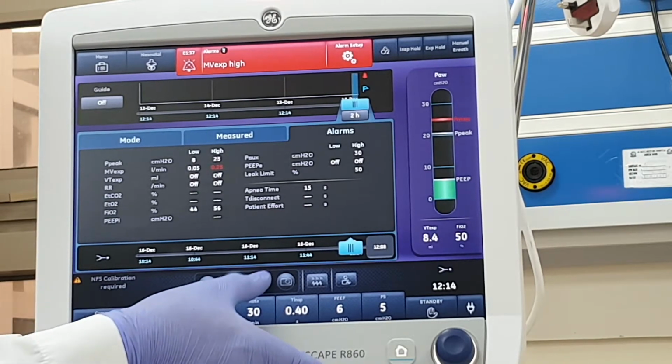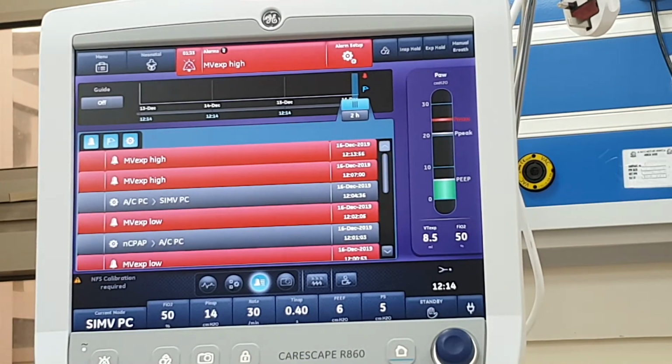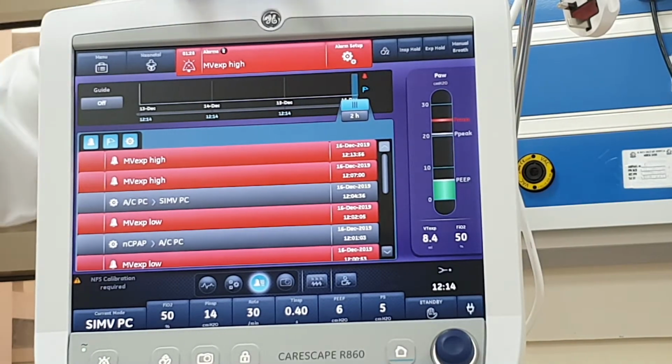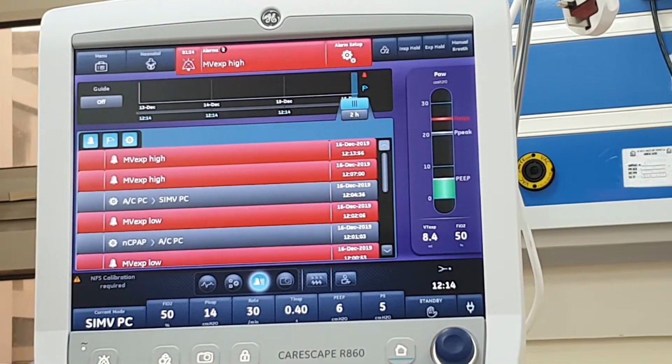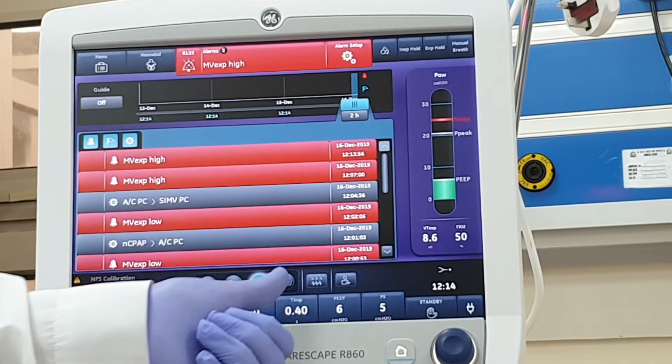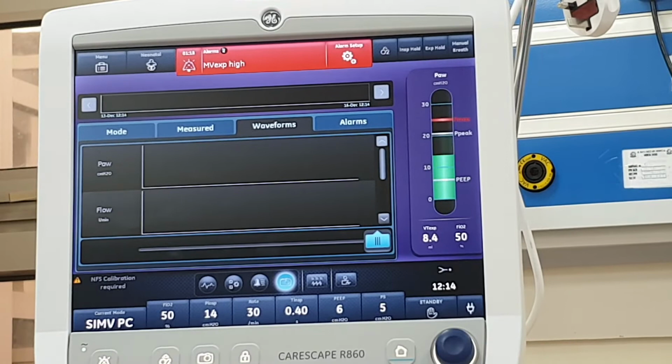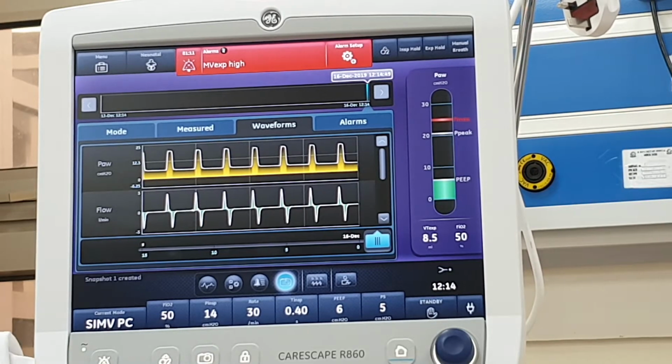Okay, well the third one, it will display all the alarms for you. So you could simply go either through the past or by hitting the icon at the top. We do have, lastly, the screen, the camera icon. So what is the benefit from that?